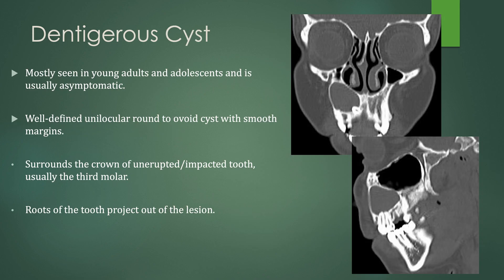A dentigerous cyst, mostly seen in young adults and adolescents, is usually asymptomatic. This is a well-defined unilocular round-to-ovoid cyst with smooth margins. It surrounds the crown of an unerupted or impacted tooth, usually the third molar, and the roots of the tooth project out of the lesion. Here's an example of a dentigerous cyst: an expansile lucent lesion with smooth margins, scalloping of the bone around it, and here is the associated molar tooth.